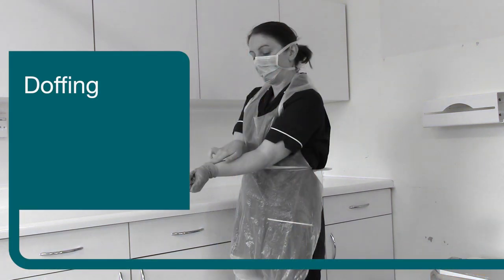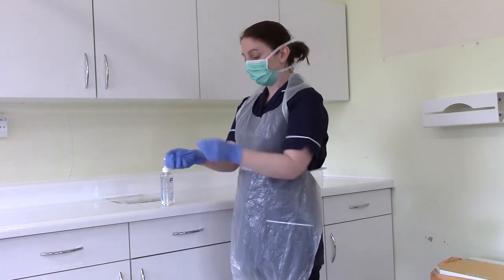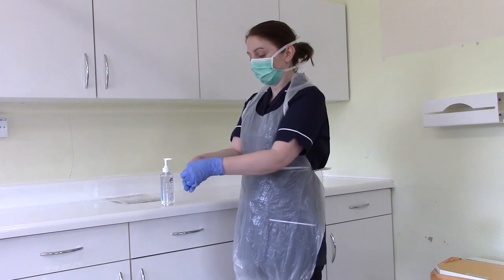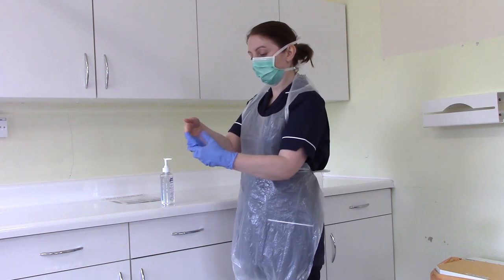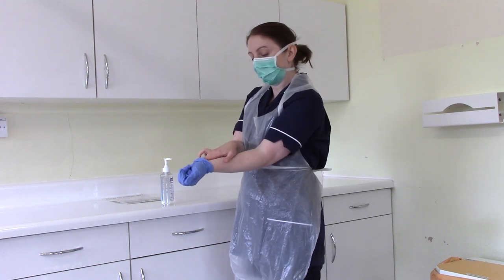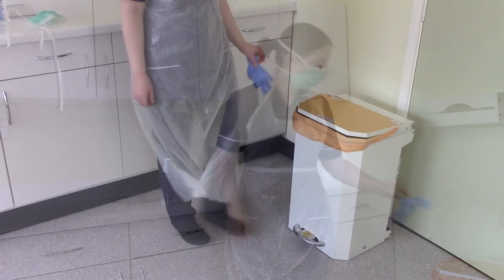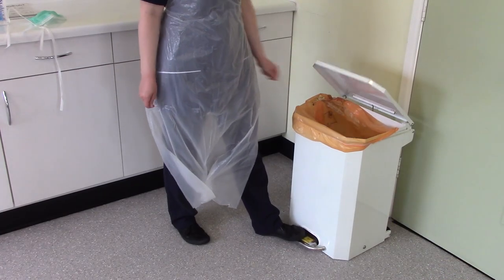It is critical that PPE is removed in the correct order to minimise the potential for cross-contamination. Step one: remove gloves. The outside of the gloves should be considered contaminated. Grasp the outside of one glove with the opposite gloved hand and peel the glove off. Hold the removed glove in the gloved hand and slide the fingers of the ungloved hand under the remaining glove at the wrist. Peel the second glove over the first glove and dispose of them as healthcare waste.